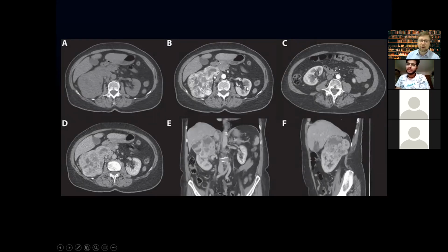This is arterial phase, this is aorta, we can see it here. We can see kidney vessels. Aorta is very bright because it's containing contrast. Without contrast, it's much darker. This is vena cava and renal veins here.